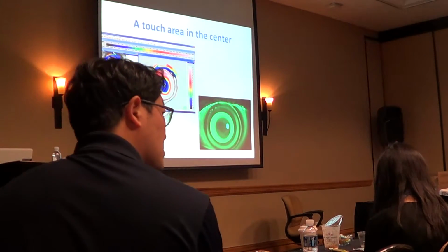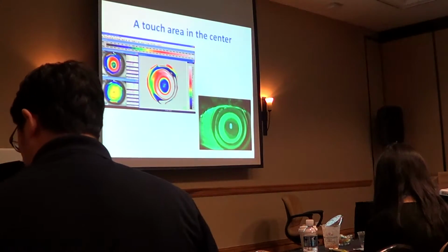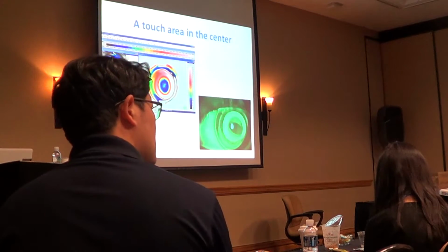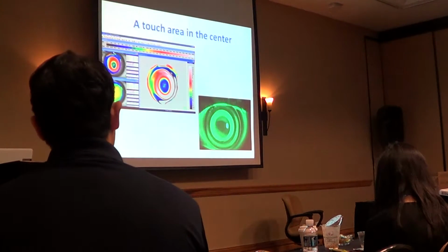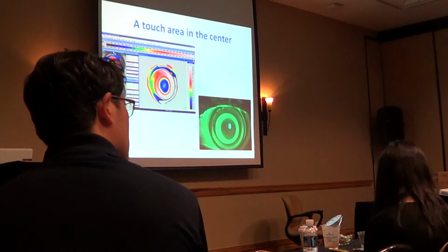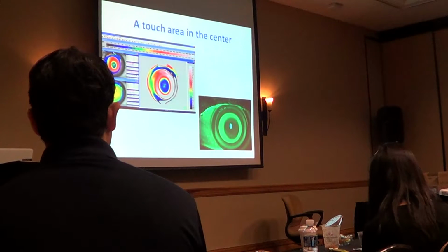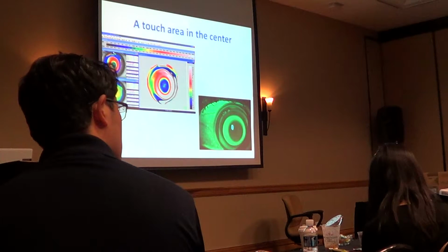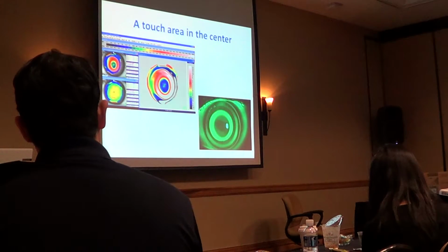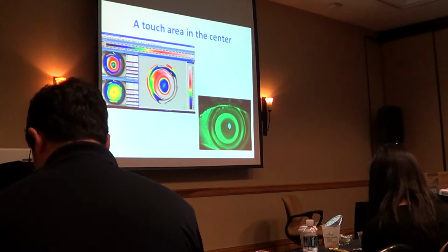If you have staining, you should change your lens. That's it, because staining means risk of infection. That's common. With no staining, you can leave the lens and wait. Sometimes things will get better. But you should be sure that you have a healthy cornea. Okay? That's very important. That's clear?